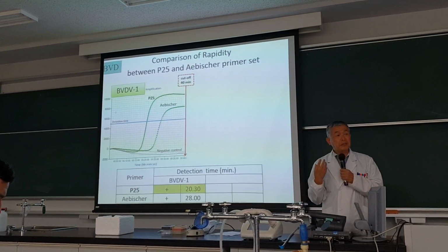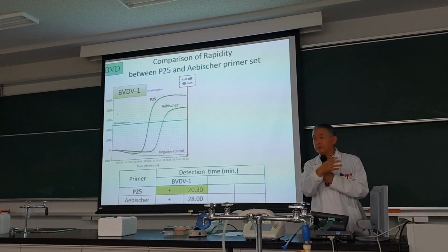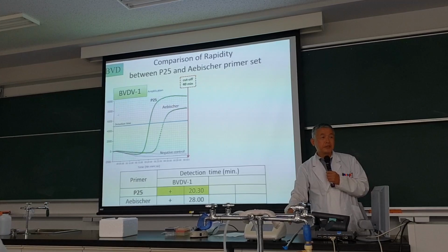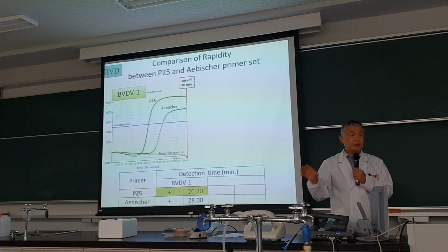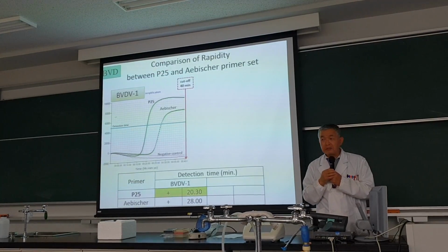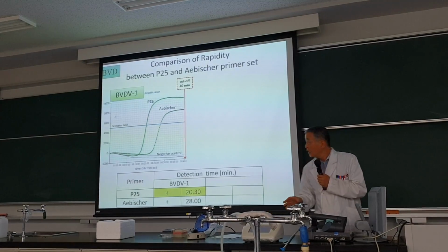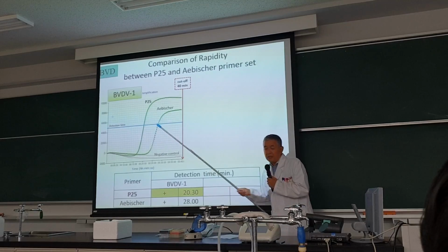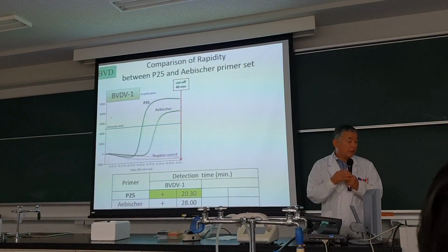But usually there is just one laboratory, and the persons who can handle the sample are very limited. In that case, we have this kind of incubator. You can bring the machine to the field and test at the place. That's why this is a good screening system. Anyway, the quick amplification can be obtained.